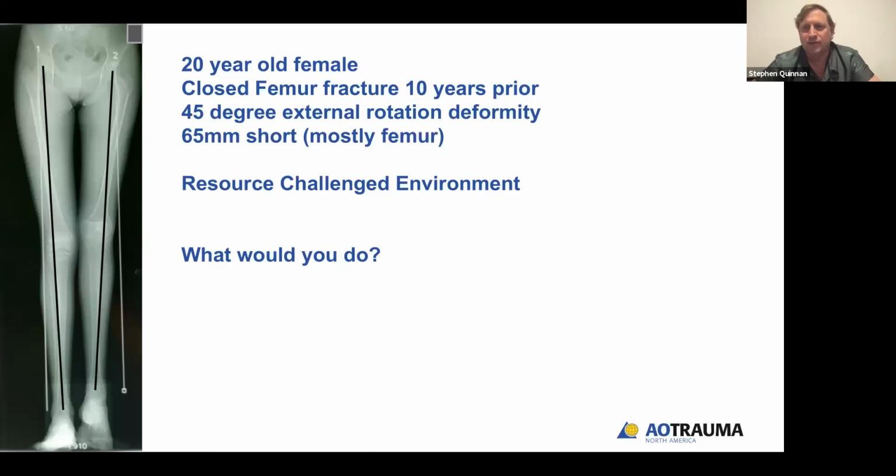There's a few things, as I mentioned in lecture. First of all, a monolateral rail, assuming we're not using rings, is all going to be loaded in a cantilever bend. It's a lot of force, and they're on a really long lever arm. So when they pull apart, they tend to bow in the direction they're pulling apart, and that leads to a varus. You have a couple ways you can accommodate for that. You can either start by hypervalgusizing the femur at the beginning of the transport, or some of them have adjustability at the end where you can make a correction for it. But that particular aspect is tough.